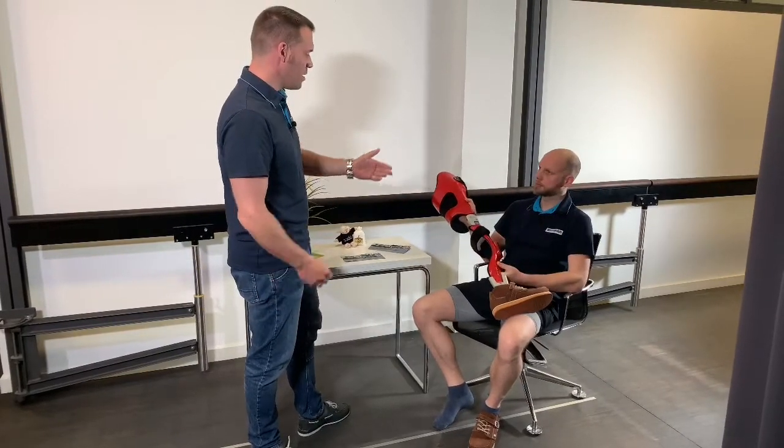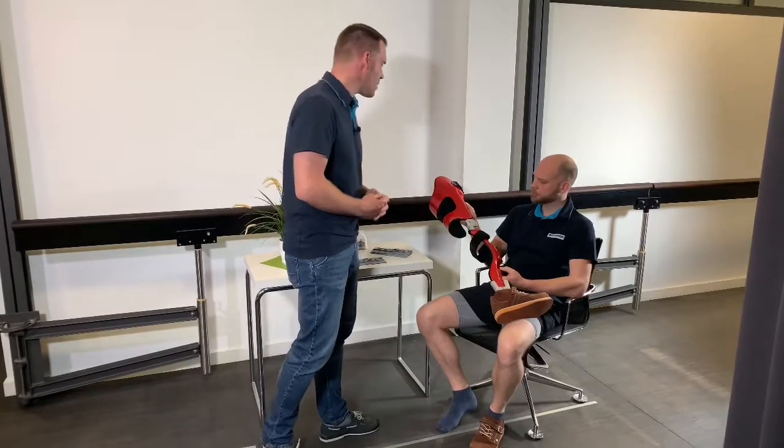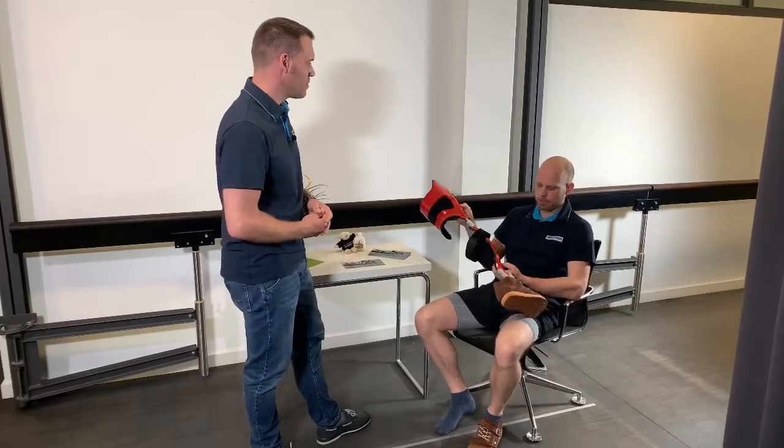Absolutely, we have designed and manufactured the orthosis individually for you in terms of strength and functionality. We have succeeded in keeping the weight as low as possible by using very high quality materials. High quality? What materials were used?